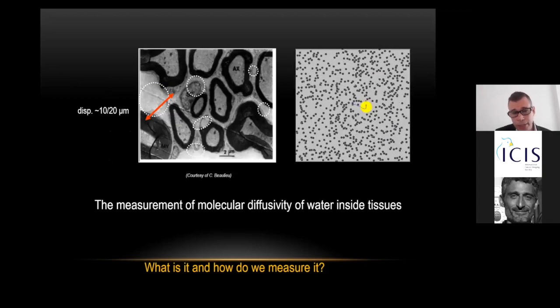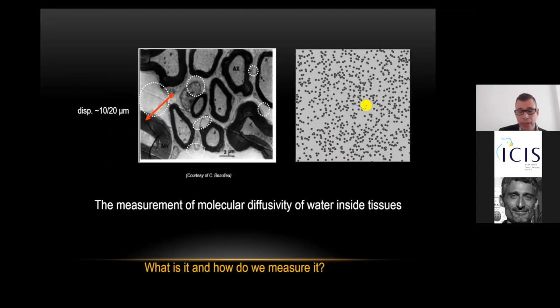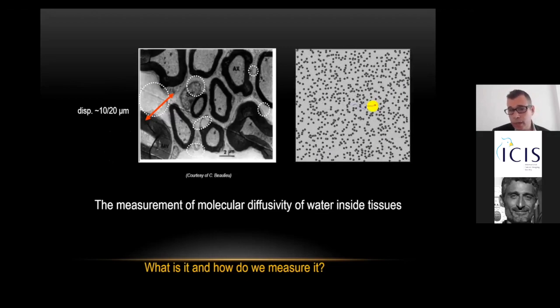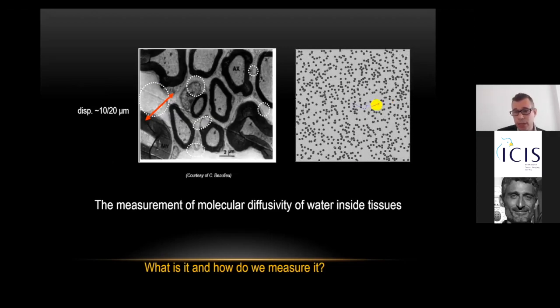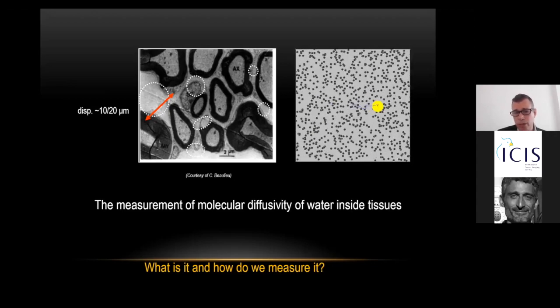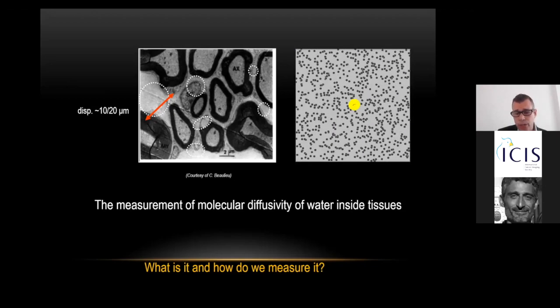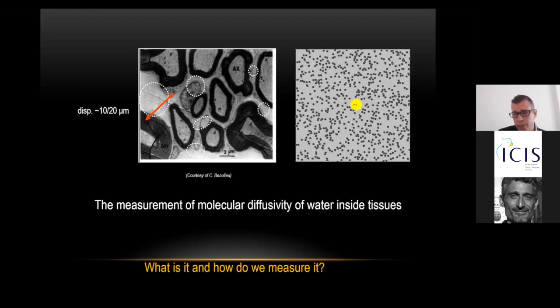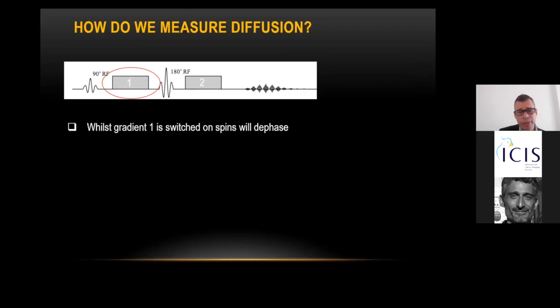So it's well established, the basis for diffusion imaging in MRI. It's dependent on the Brownian motion of fluid, which randomly passes between the intracellular and extracellular spaces. But of course, this is not free due to cellular membranes and molecular barriers. And we're assessing with our diffusion-weighted imaging a combination of the extracellular, intracellular, and microvascular diffusion. So briefly, how do we measure it?